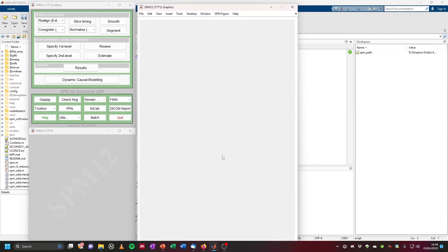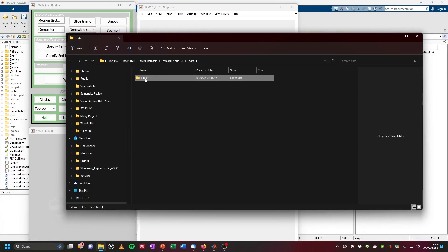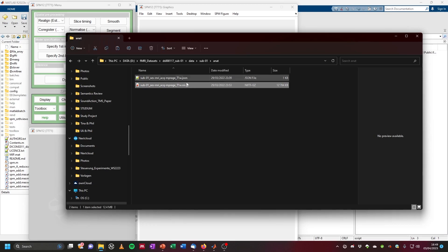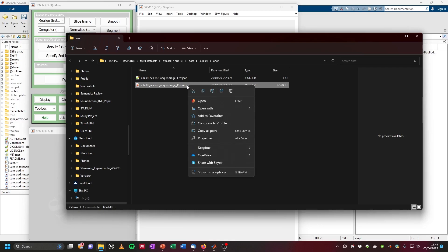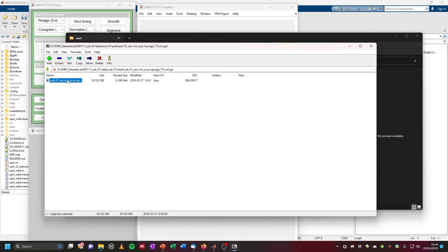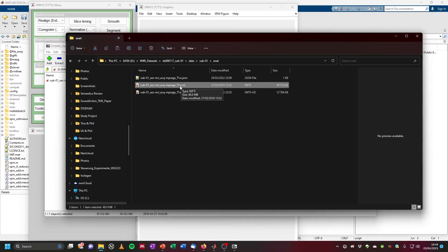As the first step, I would simply look at the structural image. We go to our anatomical folder of our subject — for example, subject one, anat. You will find a T1-weighted NIfTI image zipped within a GZ archive. The first thing we need to do is unzip this to get the pure NIfTI file, using for example 7-Zip. Open with 7-Zip file manager and extract it. Now we have our actual NIfTI image.